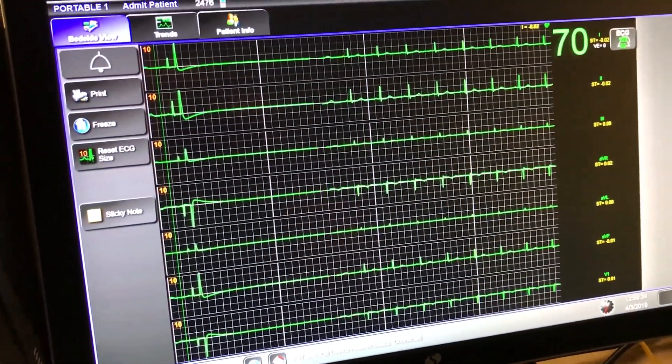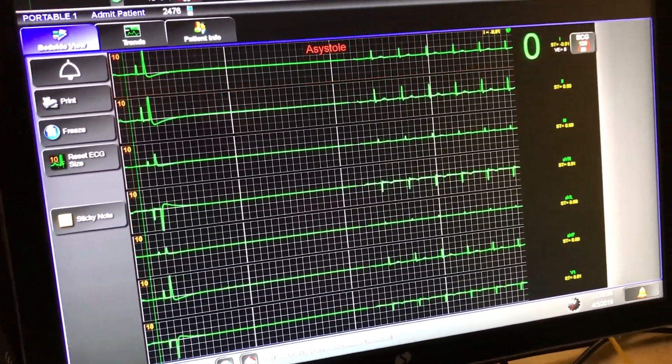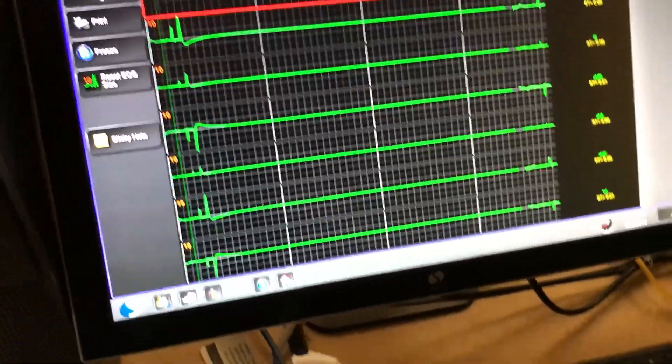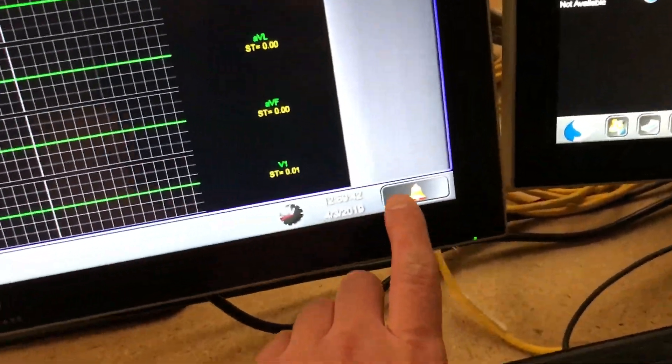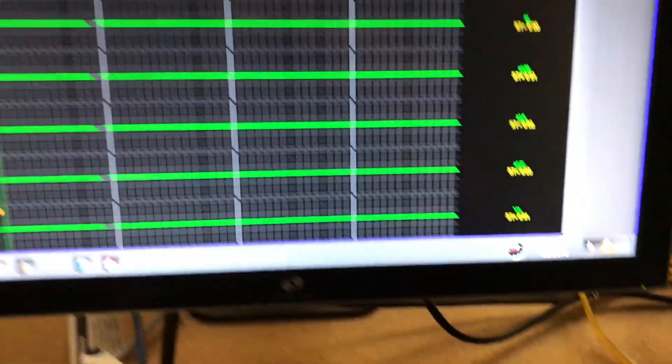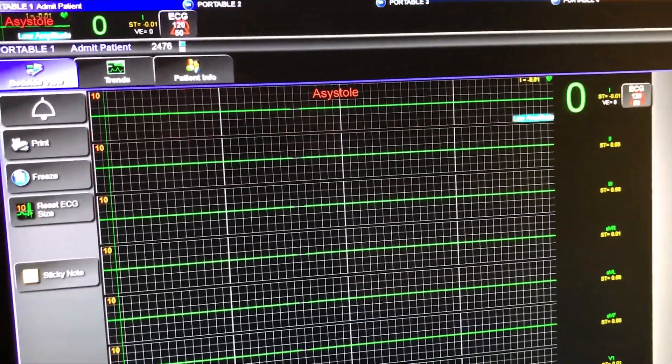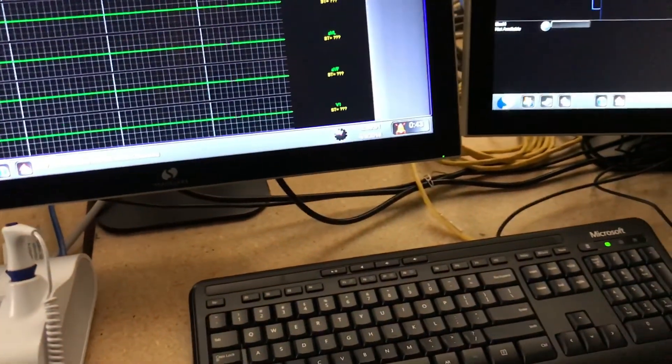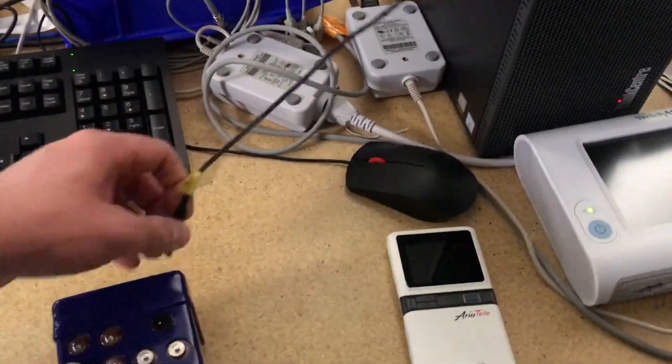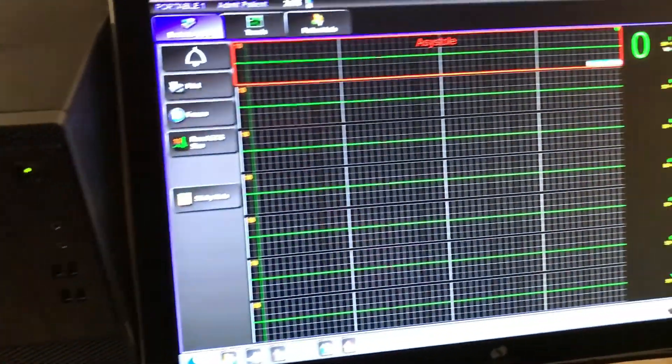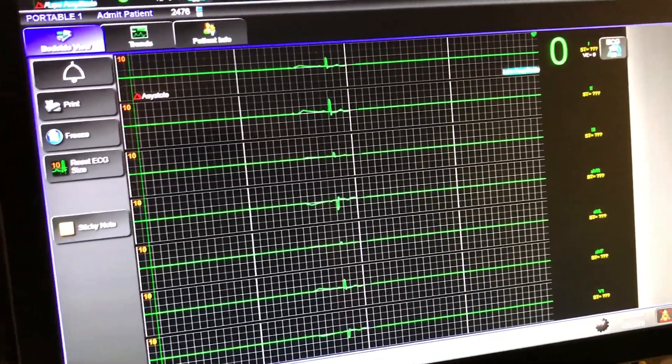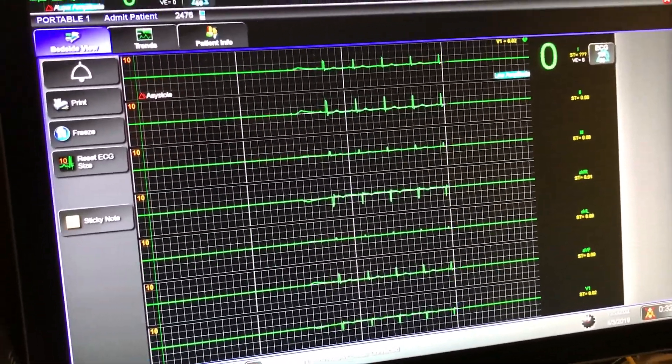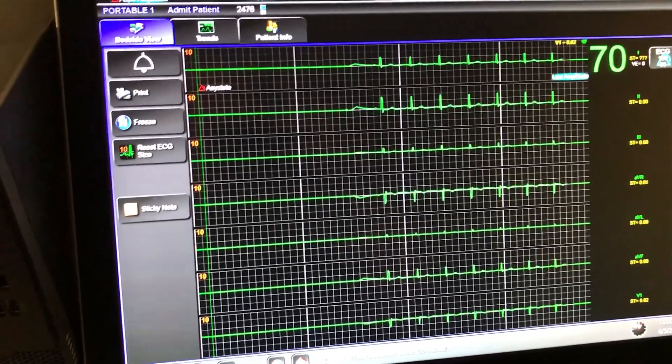At that point, the central station is going to start freaking out. I can mute that alarm temporarily. But when you plug this back in, you'll see the trend information start coming back and the central station will calm down.